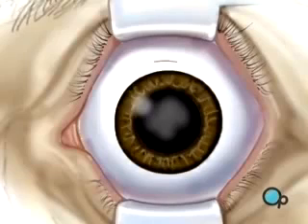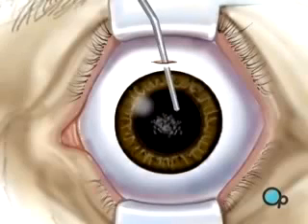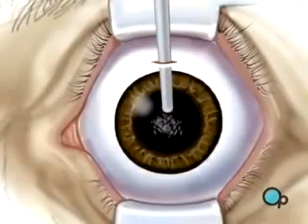The lens is located just behind the iris, contained in the elastic capsule. Next, the surgeon will open the top of the capsule and remove the lens. Most likely your doctor will use a small probe which vibrates at a high frequency. The probe vibrations break the old lens into microscopic pieces, which can then be drawn out with gentle suction.